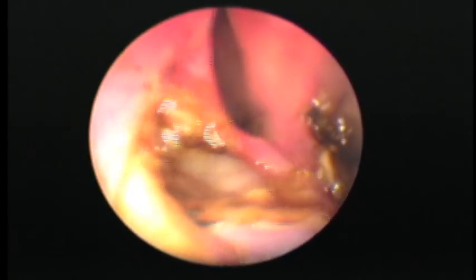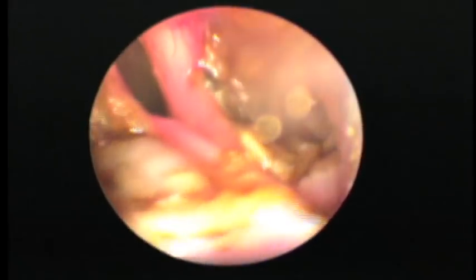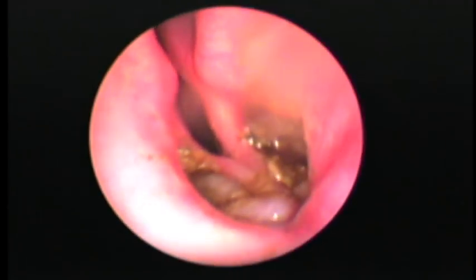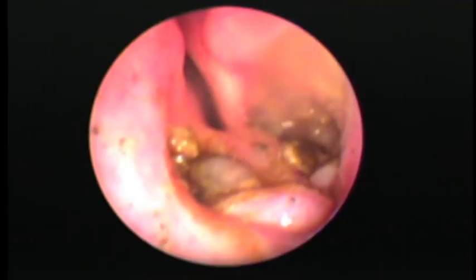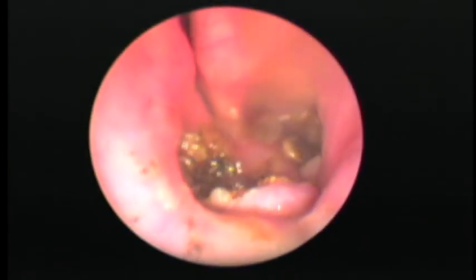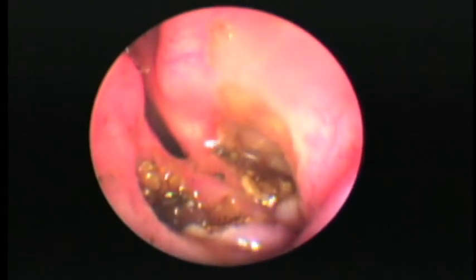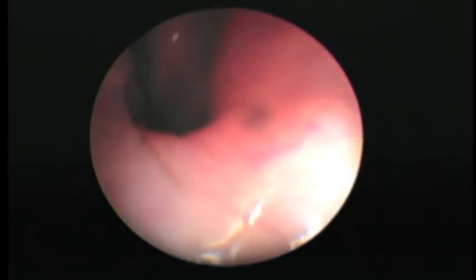We can get in there, and we want to stimulate that tissue so it sticks out so that we can attack it with the laser and vaporize it. And there it goes — you can see how fast the saccule disappears when you hit it with a laser. This works really well. Eventually we're going to take the ventral aspect of this out. We're doing it right now, and then the throat's all clear and we're done.